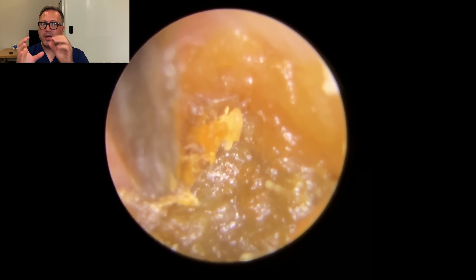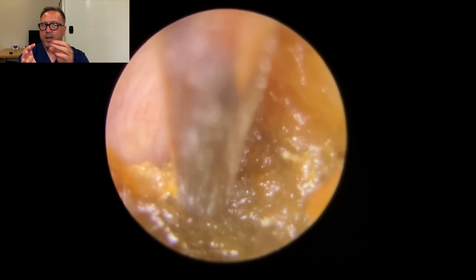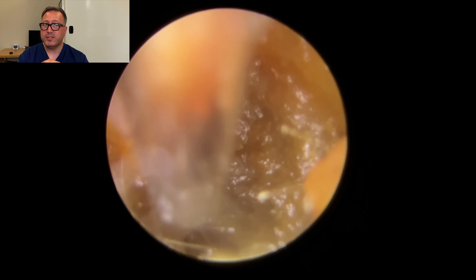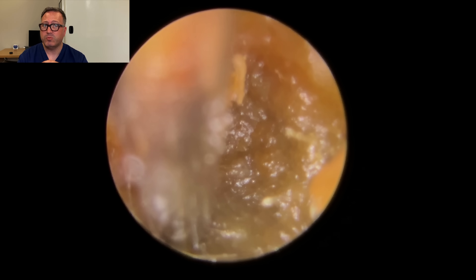The patient is a self-confessed Q-tip cotton bud user, which is why this is impacted so deeply into this canal. You can see the depression in the centre there, where the end of the cotton bud has just pushed that further in and spread the wax onto the canal walls on the sides. Our first job here is to try and remove as much of this outer section of wax, peel that away from the canal. This is the fine end on the tube because the canal just wouldn't accommodate the standard size.